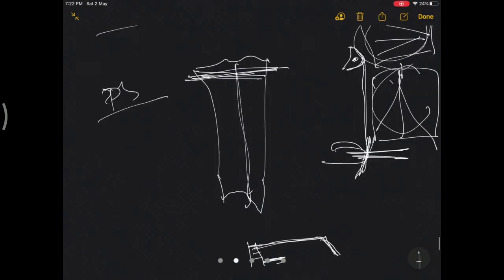And as we know, varus deformity is the most common in osteoarthritis. So the medial condyle is somewhat flattened or worn off. If you measure the thickness from the medial condyle, then you are leaving that amount of worn tissue out of the measurement. Okay, so you will have to address that, otherwise you will be cutting more.